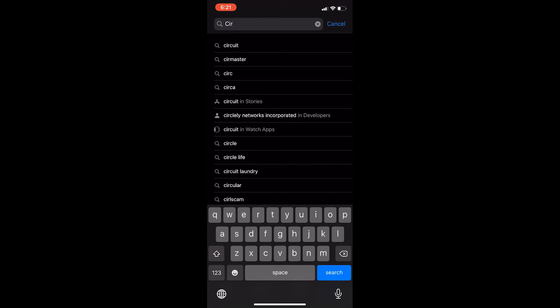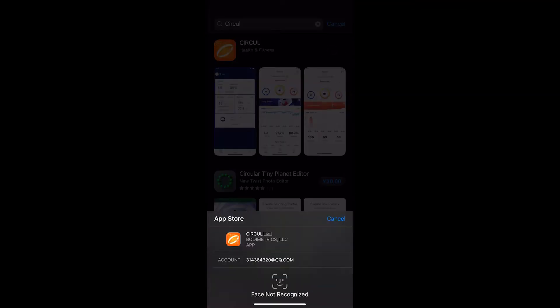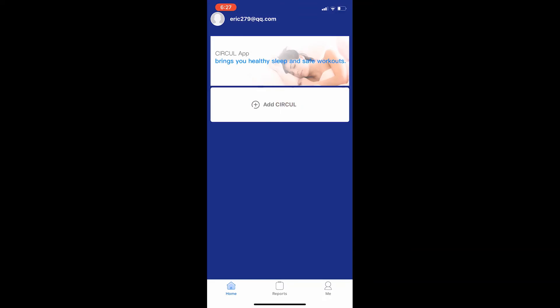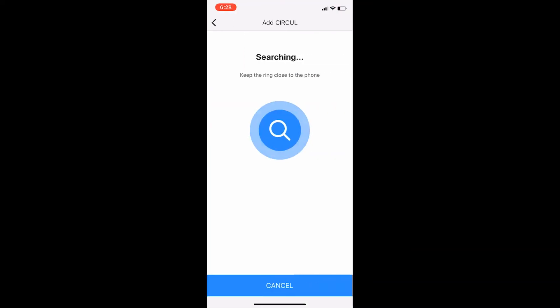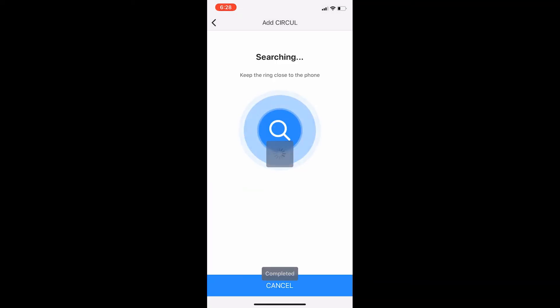In order to use the ring, go to Google Play or the App Store and download the CIRCUL app. Turn on Bluetooth on your mobile device and then open the CIRCUL app to pair with your device. Keep the ring near your mobile device for proper connection.